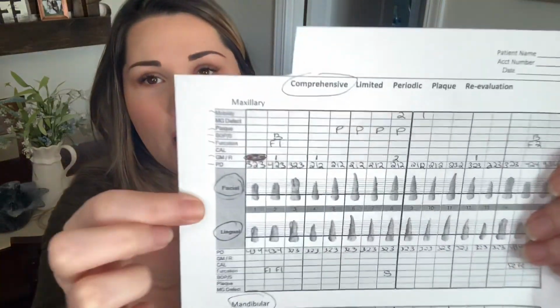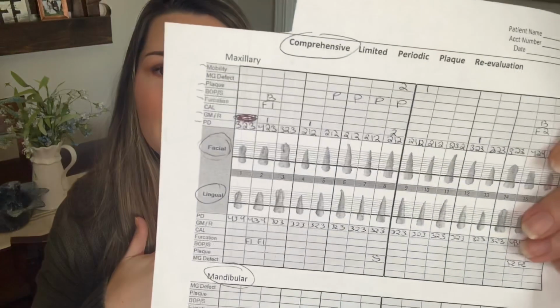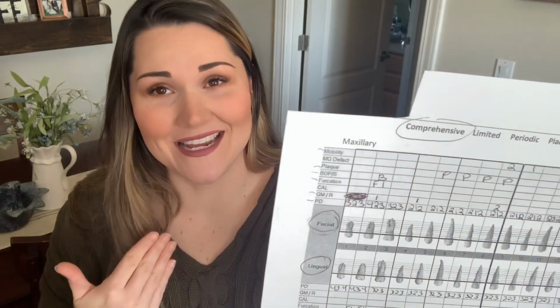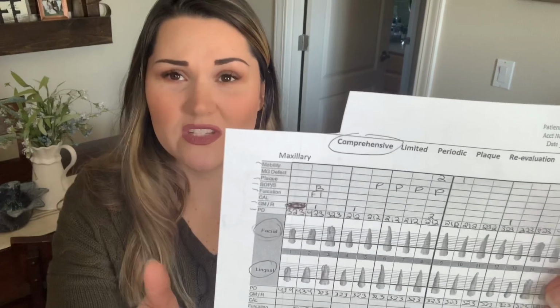Anywho, there's quite a bit of info on this piece of paper, so I'm trying to get it all out there. Right here on this side of the piece of paper is basically what you're going to be measuring. Now, I personally don't ever do the MG defect, or the CAL. Not sure, I'm not a hygienist, but I personally have never gotten those measurements from a hygienist.